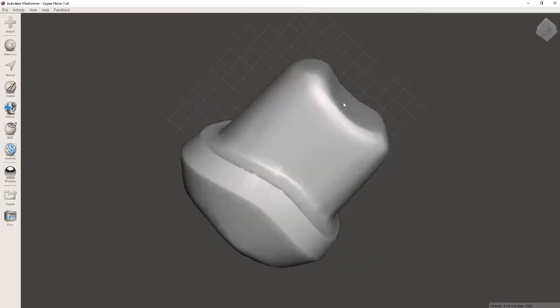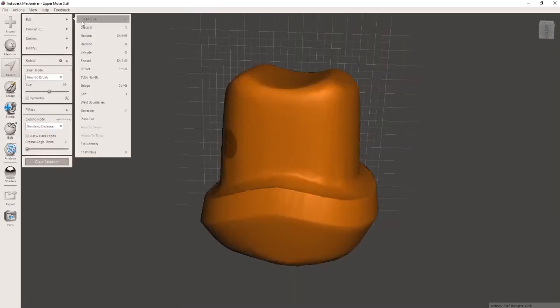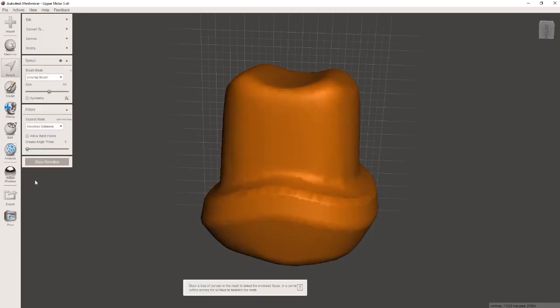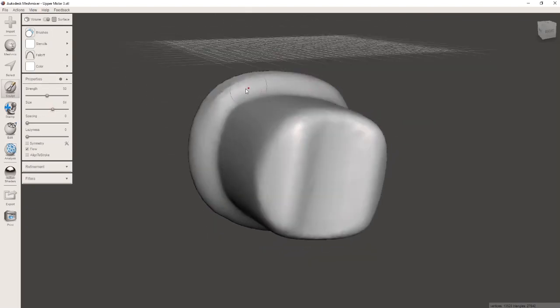So this is Meshmixer, and the first thing I have to do is import each STL file. In this case, I have to remesh it because I want to adjust it, and I don't like the big margin on this die. So I'm using the sculpting tool in surface mode, and I'm smoothing out this fat margin all around it.